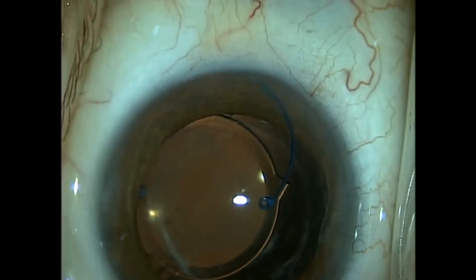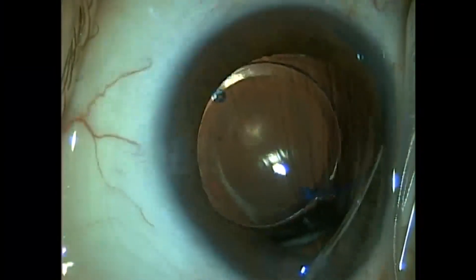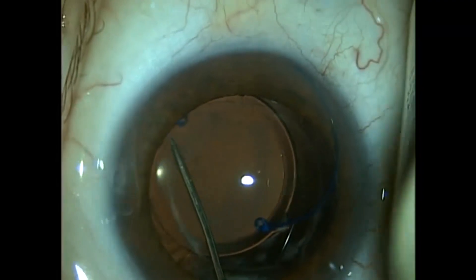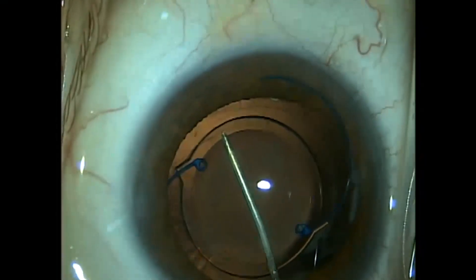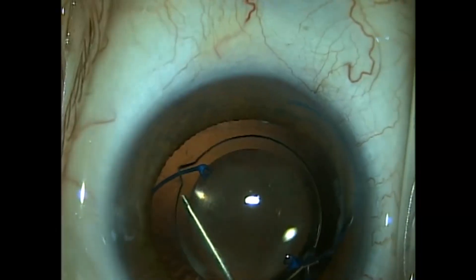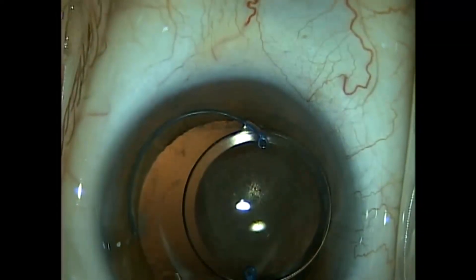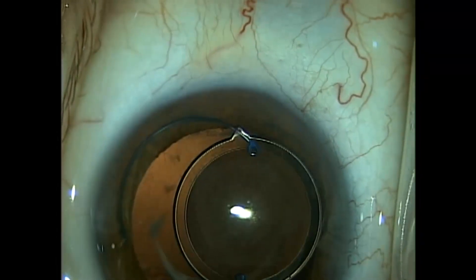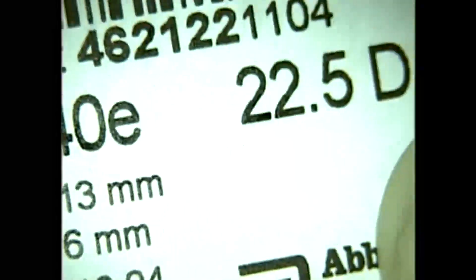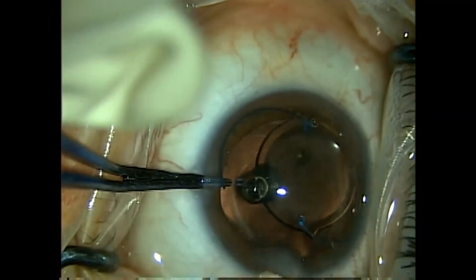We use a cyclo-dialysis spatula to spin the lens out — it reminds me of changing a bicycle tire, just spinning the lens out of the bag. Now we've got the lens out of the back. We expect there is going to be vitreous presenting itself in the anterior chamber. We take our acrylic lens — a Sensor AR-40E lens made of acrylic — and before I take the silicone lens out, I'm going to go ahead and insert this acrylic lens into the eye, into the sulcus.